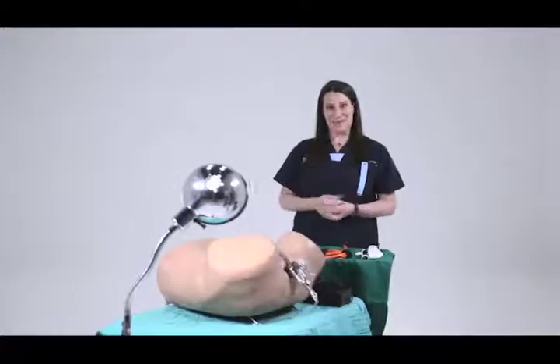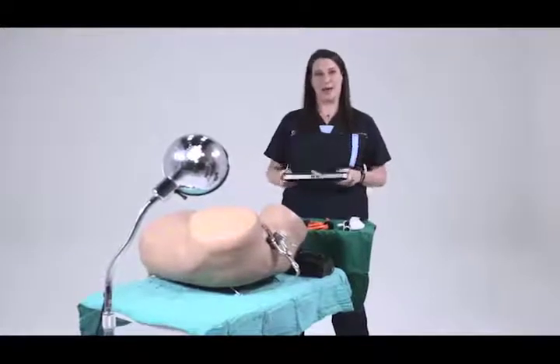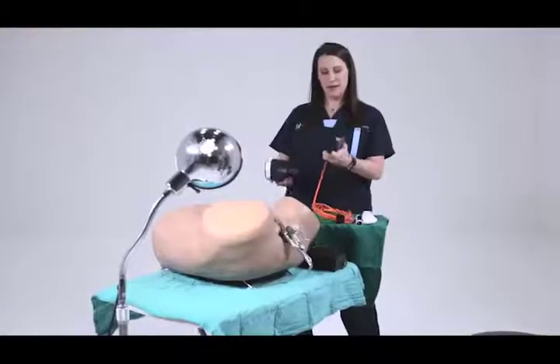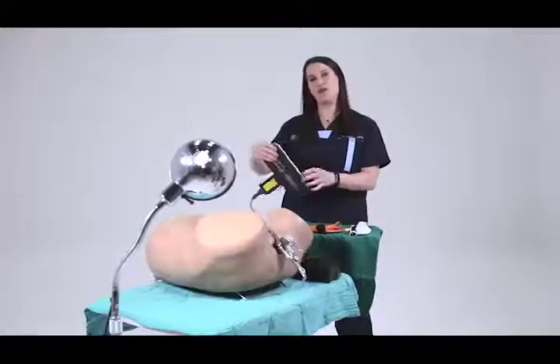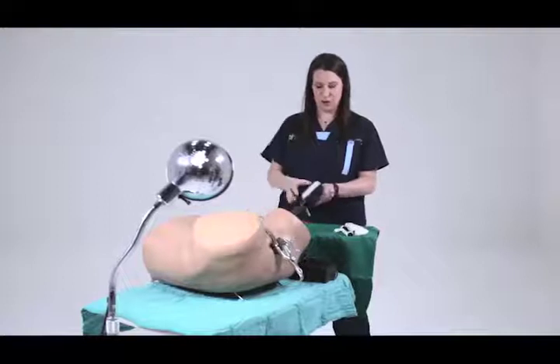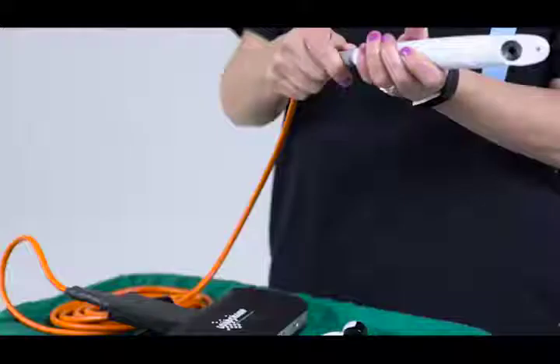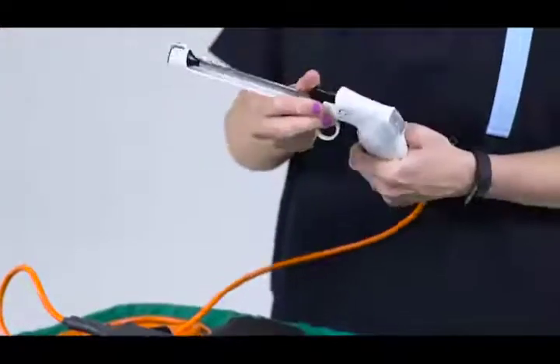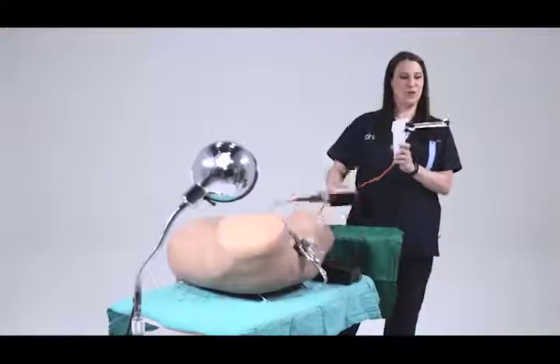One of the most exciting things about this device is that you don't need electricity to use it. This is an external battery pack. It weighs about two pounds and it can be connected to the device very easily. This cable gets connected to the external battery source. It can be used a hundred times without having to recharge it. Then it's connected to the probe, and you can see it works with no electricity.